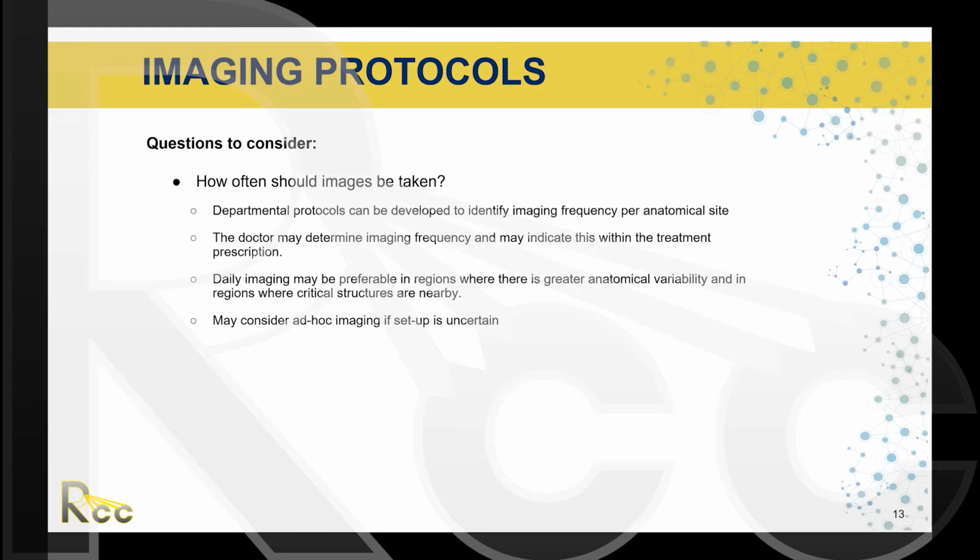Even with imaging guidelines, therapists may choose to image for a number of reasons, including to verify a difficult setup or if marks have washed off. So if a therapist is working on the treatment machine and sees something or gets kind of a feeling that things aren't setting up as they should be, it's really great to be able to take a quick image and make sure that everything is lined up appropriately.